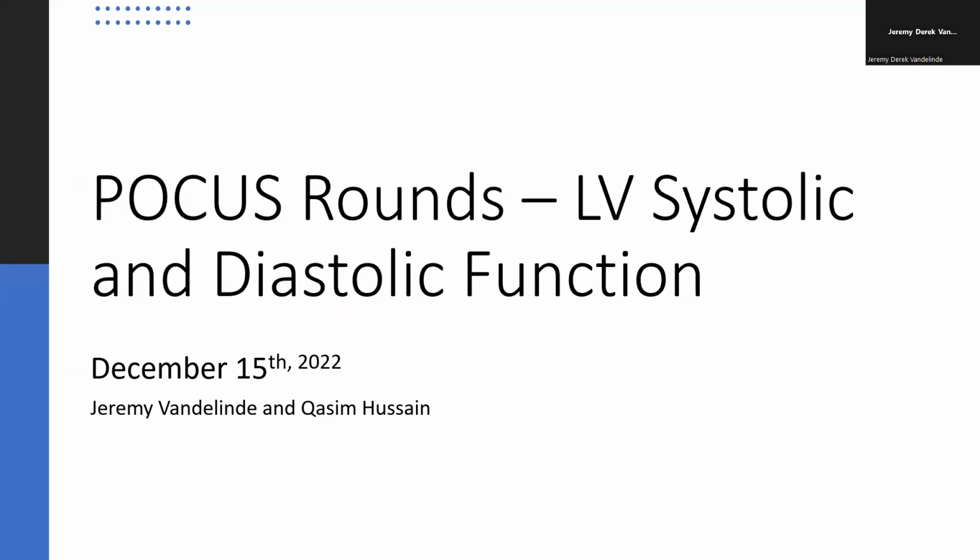And as Dr. Yu mentioned, our goal today during our ultrasound rounds is going to be an encompassing picture of left ventricular function, and more importantly, dysfunction. So we'll split that into two different talks, the first being on LV systolic function, and the second, done by my colleague Qasim, is going to be diastolic dysfunction.